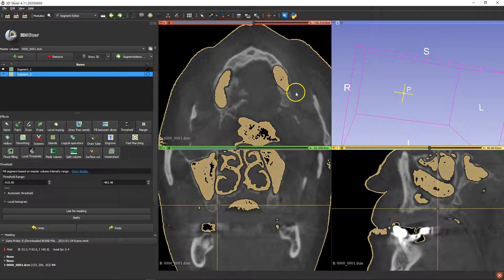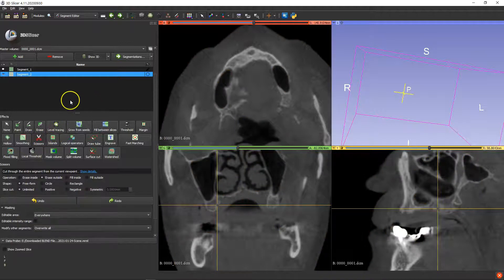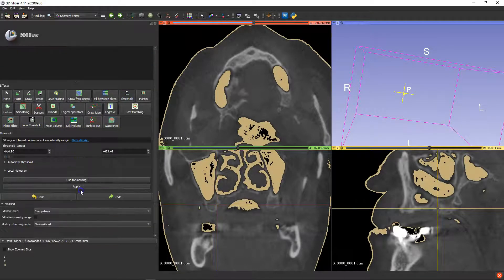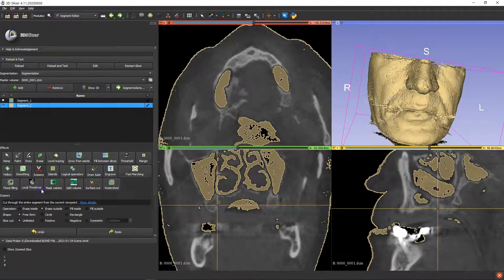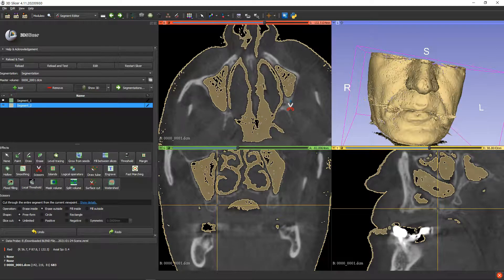What we're going to do this time around is select this entire region and then cut out what's on the outside. What just happened is I should have applied it first. So we're going to go back to threshold, apply the threshold, and then go to the scissors and cut this out.